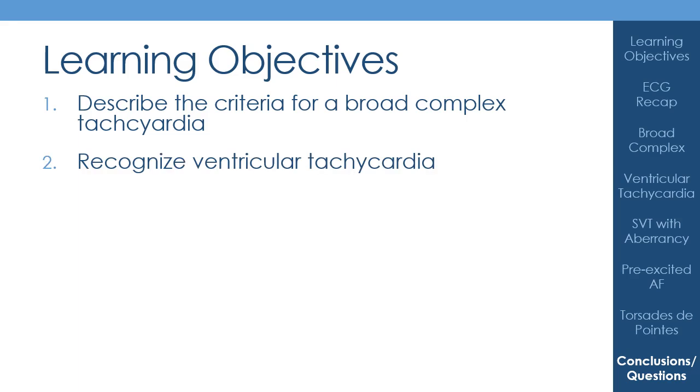We've talked about ventricular tachycardia and how to recognize it. In particular, it's things like capture and fusion beats you might be looking for. You're looking for a broad complex regular tachycardia, and that's crucial for VT. It should be broad complex and regular. There are some features that might make you suspicious this was ventricular tachycardia over another cause of broad complex tachycardia, for example left bundle branch block in somebody who happens to be going quickly, and the cardiac axis in particular. But the key way of thinking is that if it's broad and regular, this is VT until I've proved it otherwise.